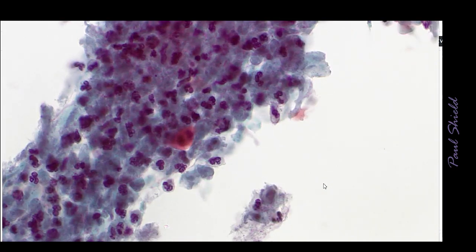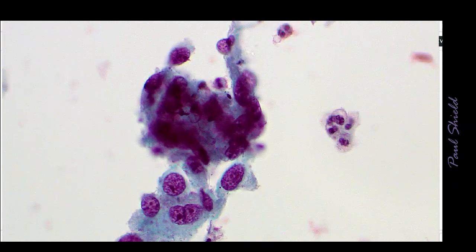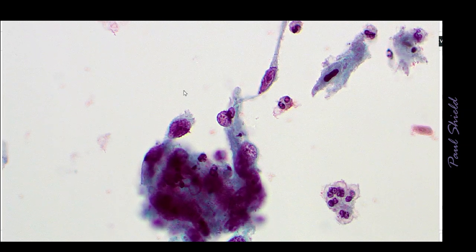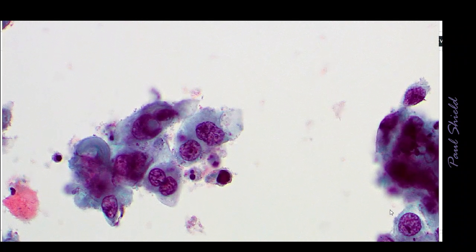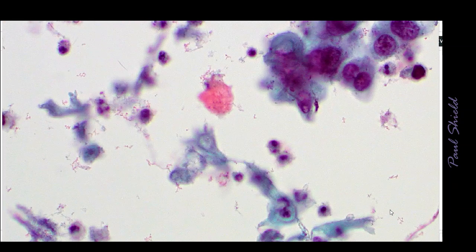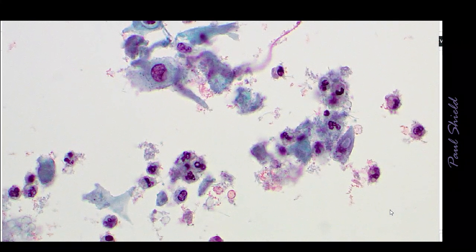Often you'll have quite bizarre shaped orangiophilic cells like those ones in amongst the clumps as well. And the other thing you commonly see is just a lot of broken down blood. So that is fibrin and degenerate red cells. Again, nice malignant chromatin in those for me, coarse irregular chromatin. And notice you start getting pleomorphic cells too, like this spindle, elongate shaped nucleus. Often they're hiding in amongst clumps of that necrotic debris and blood. Again, you can see more of these cells just in here, and all this material is necrotic dead cells, broken up red blood cells, fibrin. This is what we call a tumour diathesis.